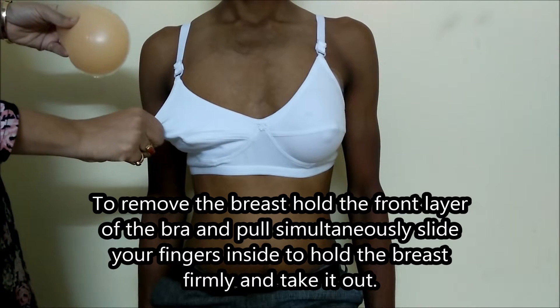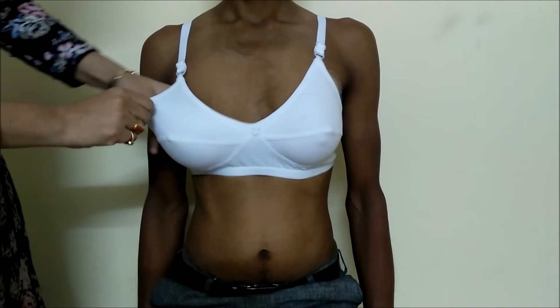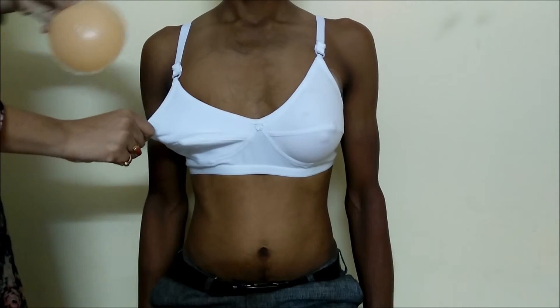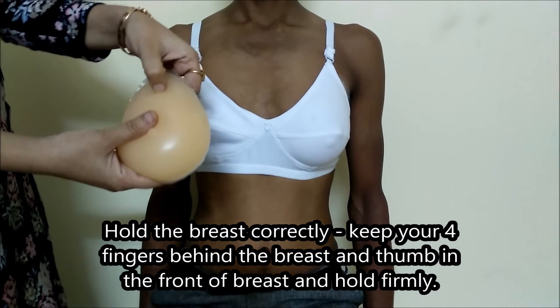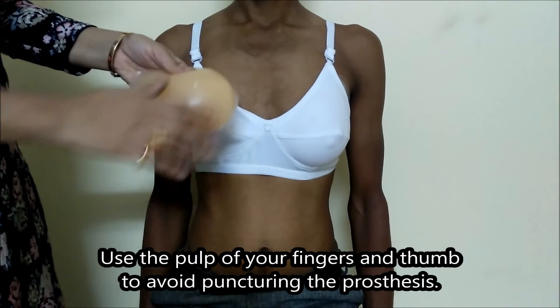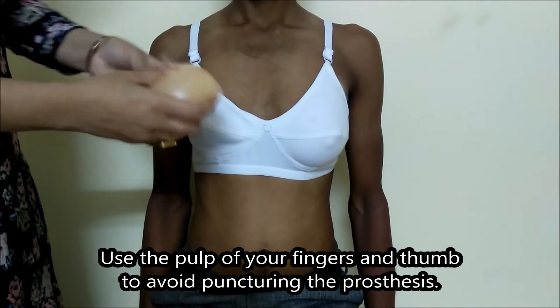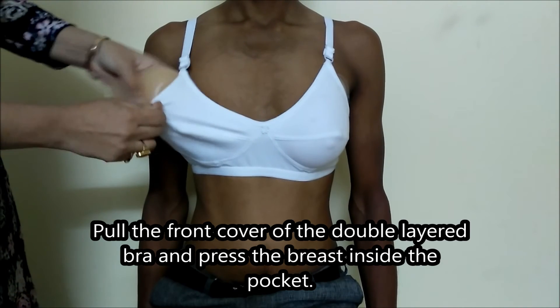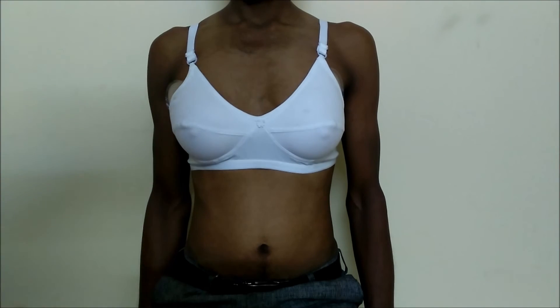slowly pull the breast out. You have to make sure that you are holding with the pulp of your finger, not the nail part, so that you don't damage the silicone cover. You can understand that it's a soft one, so wearing has to be very delicate. Thank you.